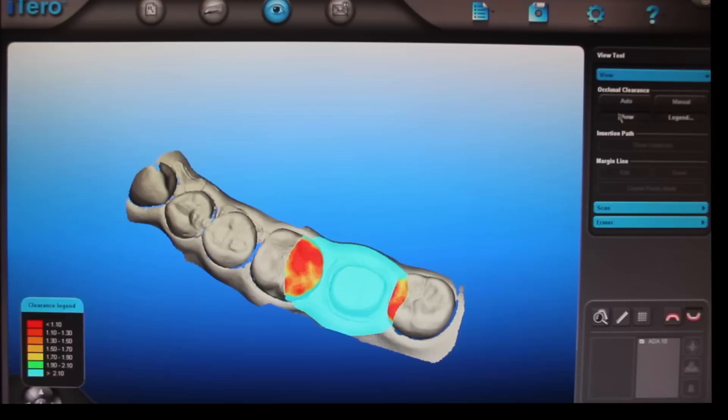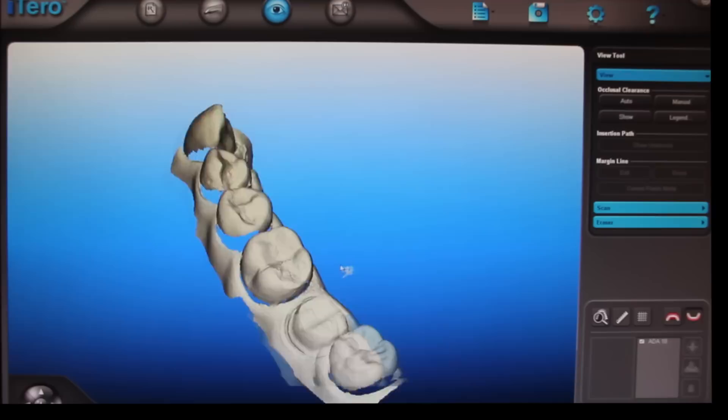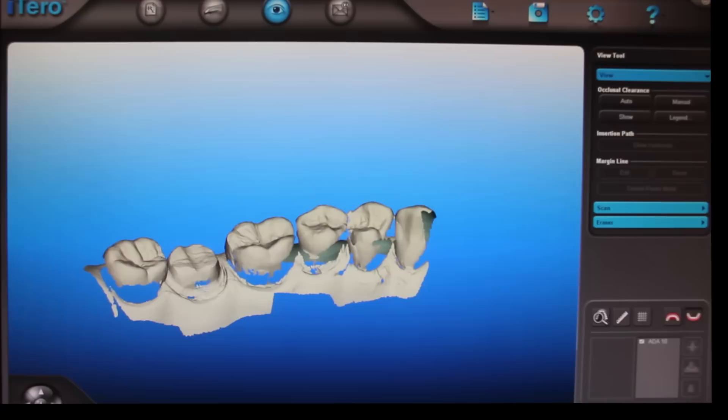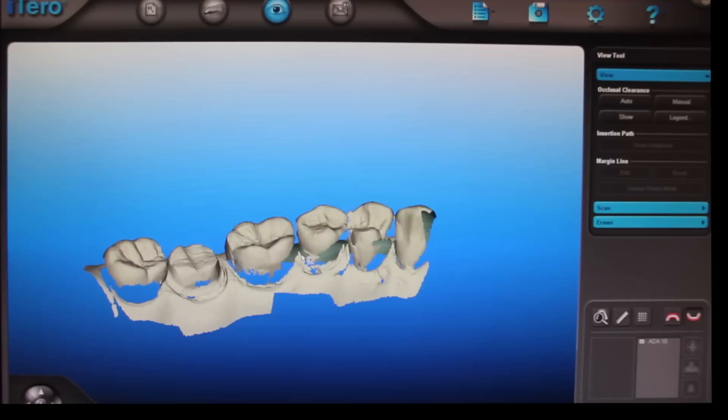And then we can turn the tooth on its side. You can make sure you have all the information you need, which in this case we do. Any little spots like this one here, you can extrapolate that in and it's not going to affect anything. But if you would see that on a margin somewhere, or on a contact of an adjacent tooth, then you'd want to go back and add a scan to that.